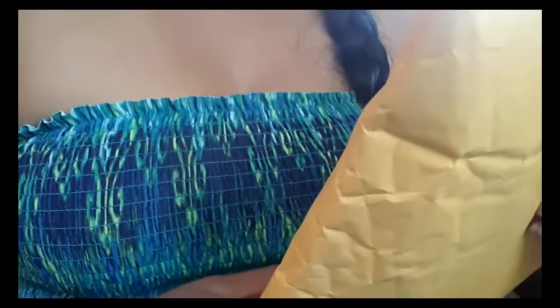Hi everyone, I got two new menstrual cups in the mail today and I just wanted to do an unboxing and my first impressions on both of them.